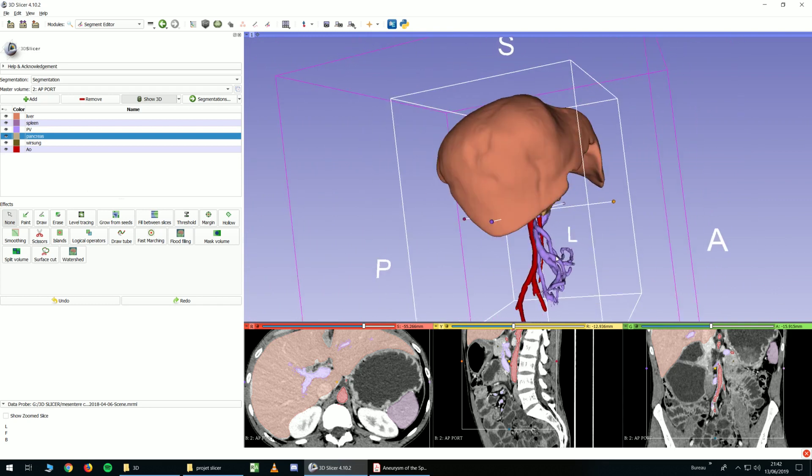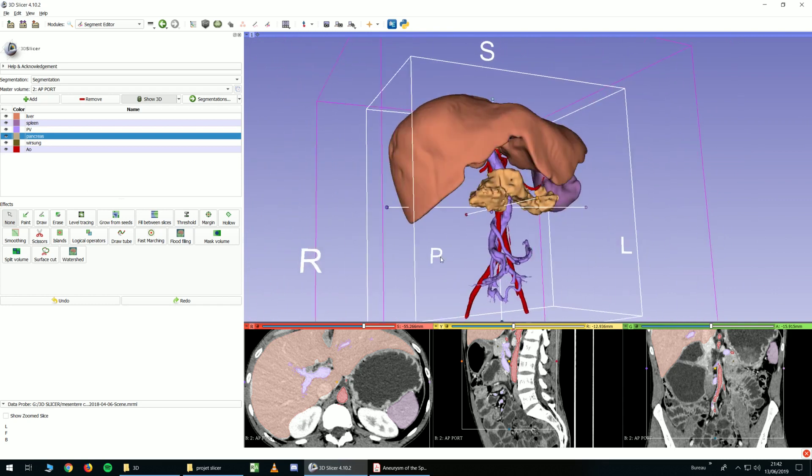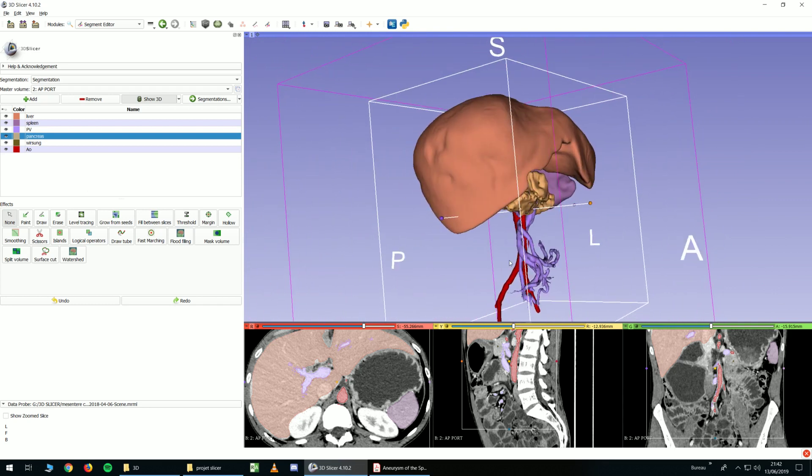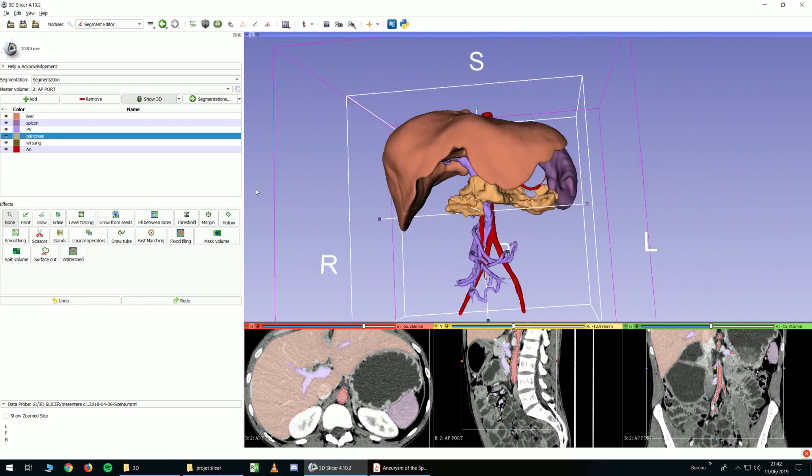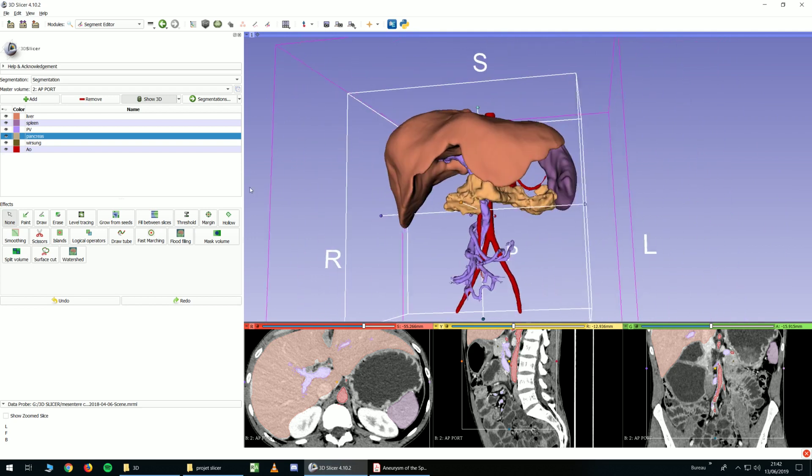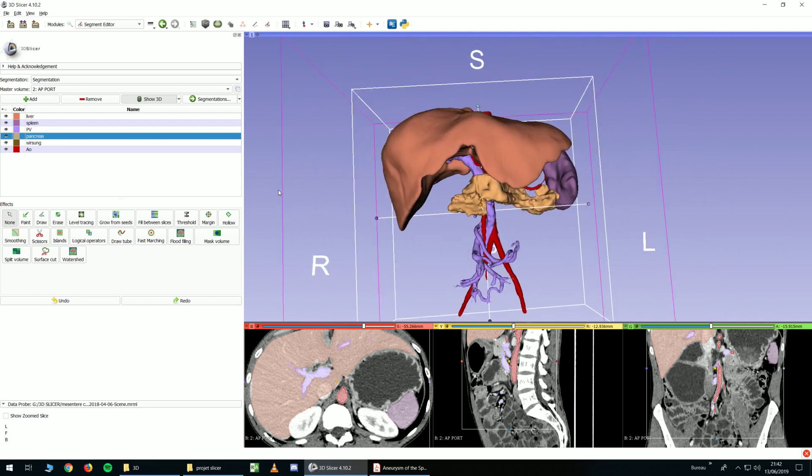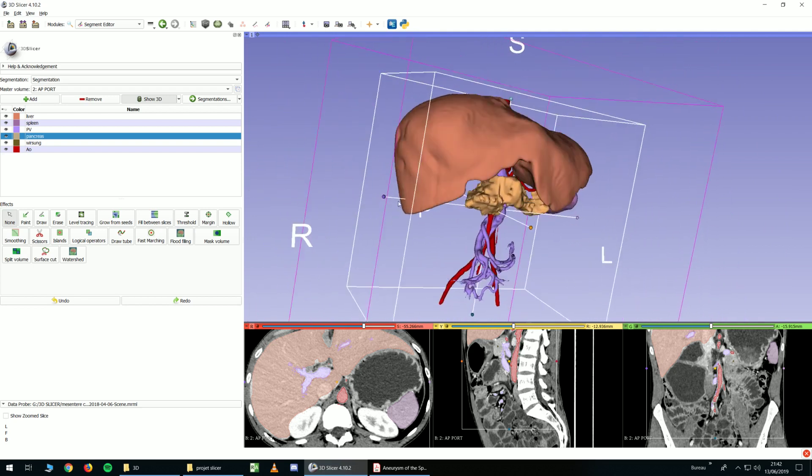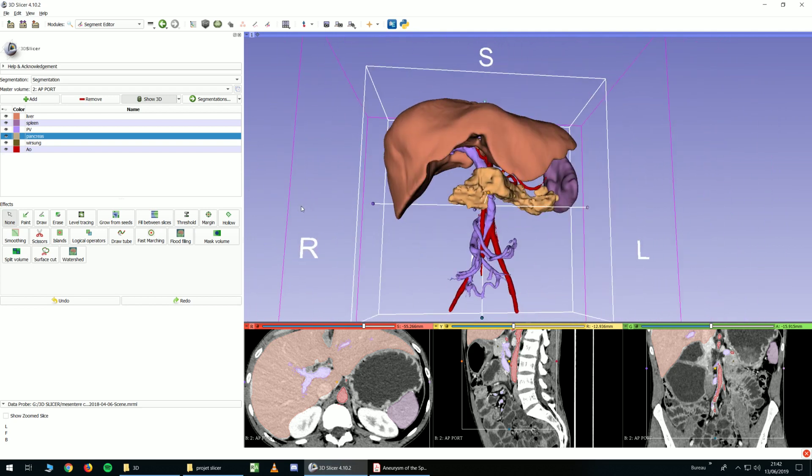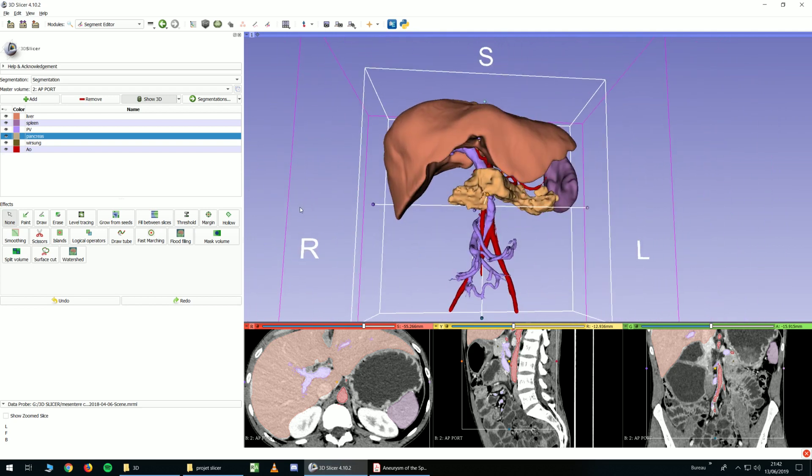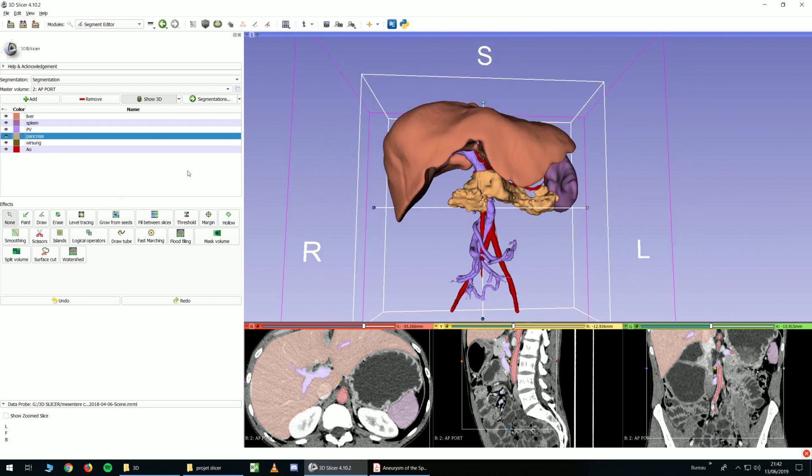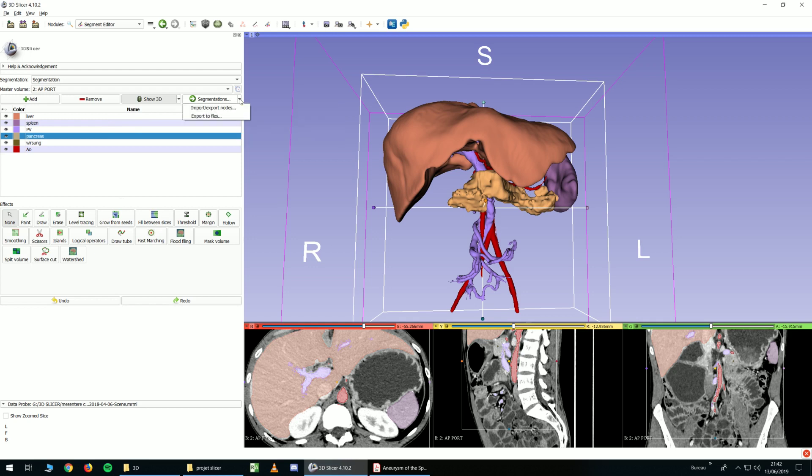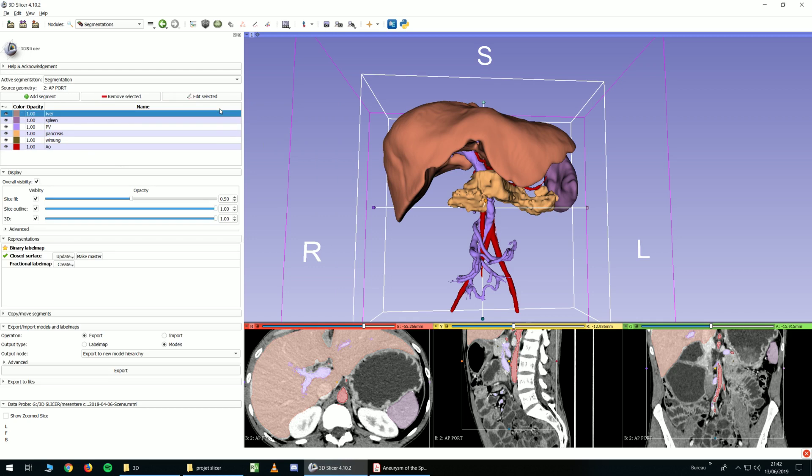Let's say I want to export these models and maybe do something with it in Blender, for example, or for 3D printing. You have to click on here next to segmentation and import export nodes. And then you have to go here, export, output type.